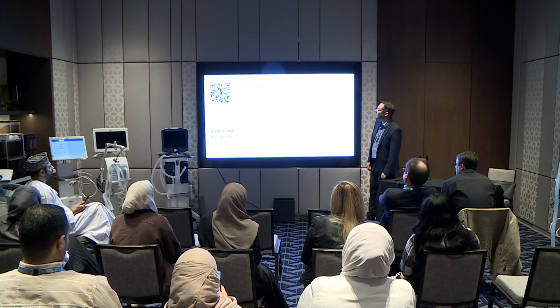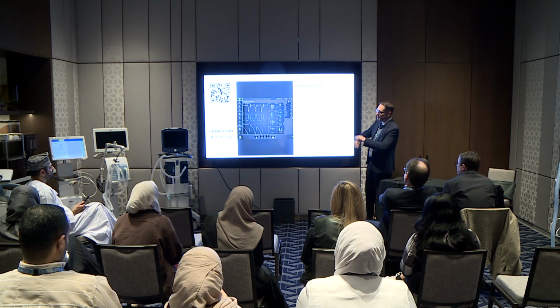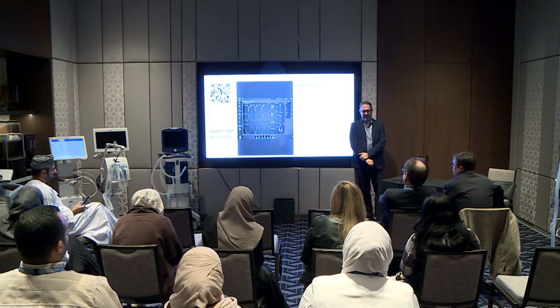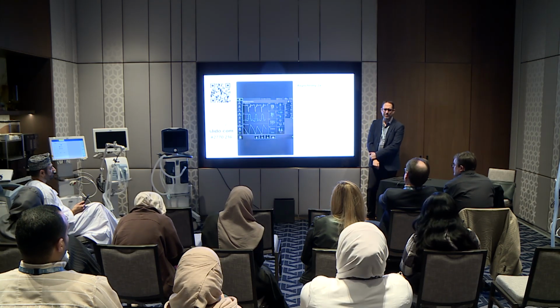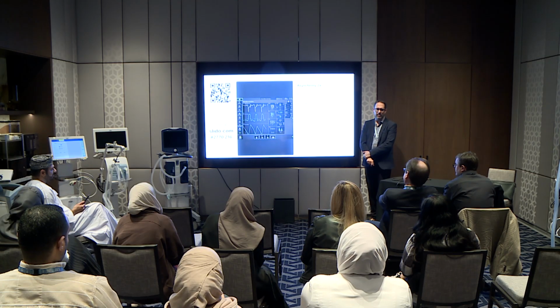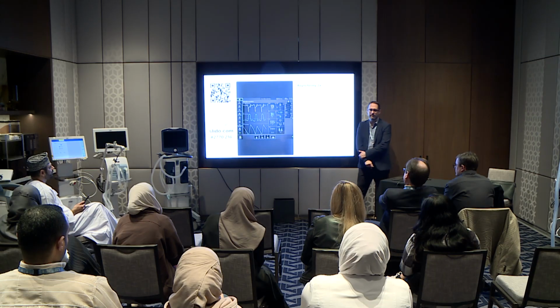Okay. This is the one. Wait, it's a different one. Okay. This one should go a little faster. The last one, I wanted to start you off with the most difficult one. The rest of them, I would argue, are less difficult. This one should be very obvious. It's volume control mode.